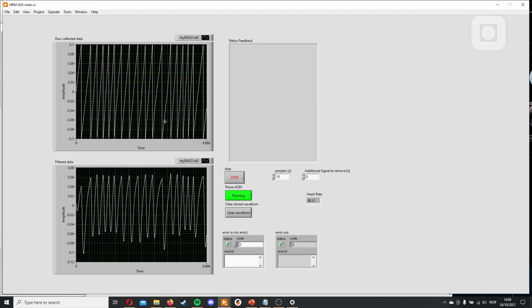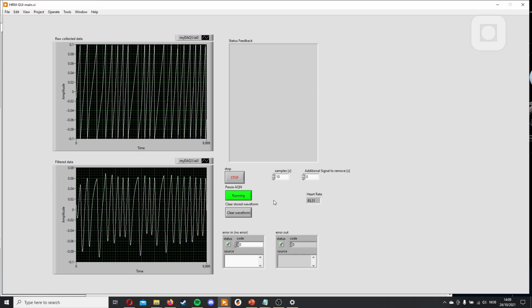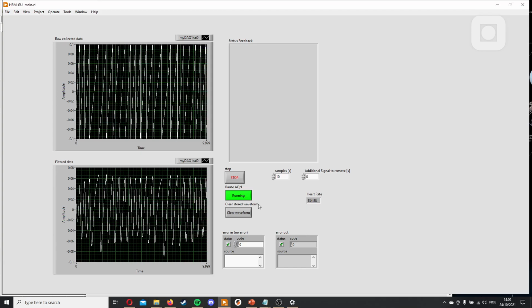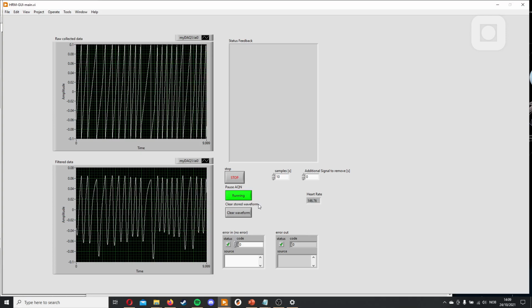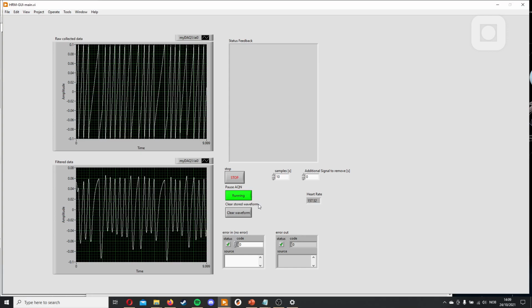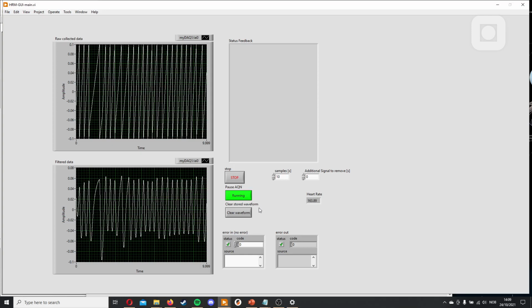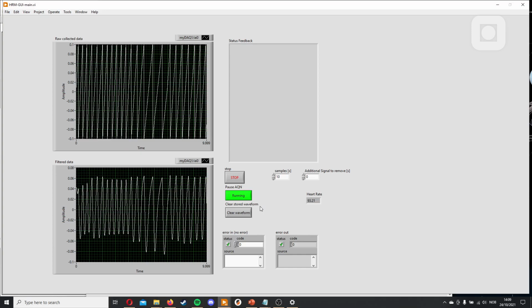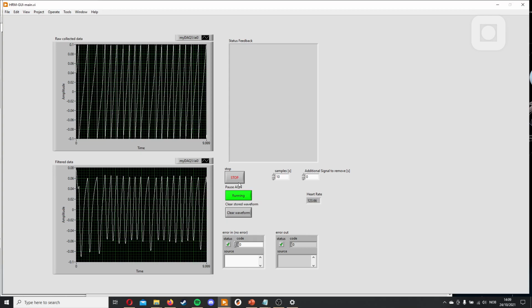A lot of people have the tendency to make their whole application into one VI where they can easily clear data by using local variables and handling. But as you see, it's not that much extra work doing it a proper way, where you have compartmentalized each functionality into its own loop. It would maybe have saved us 2-3 minutes if we had just one large VI, but in the end, this allows us to do much more when we have each of the functionality or the modules in separate loops.